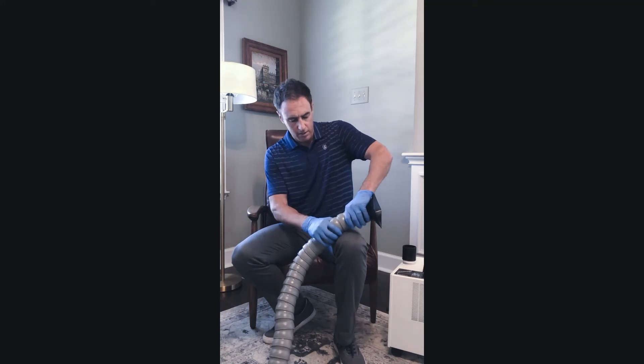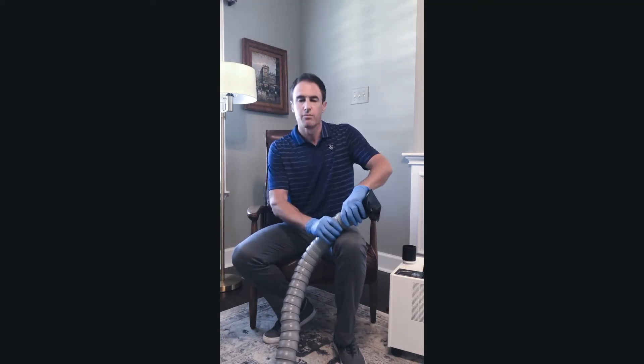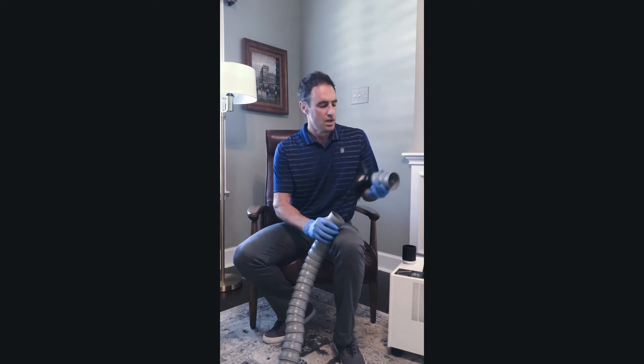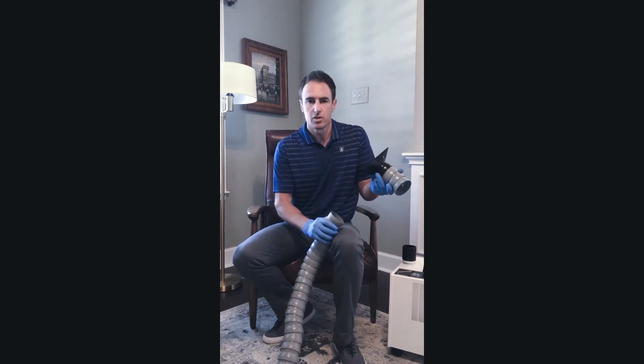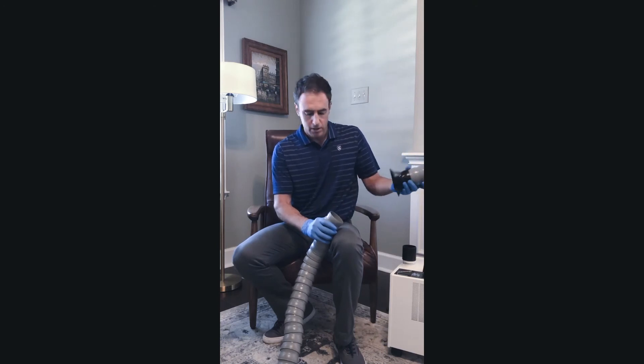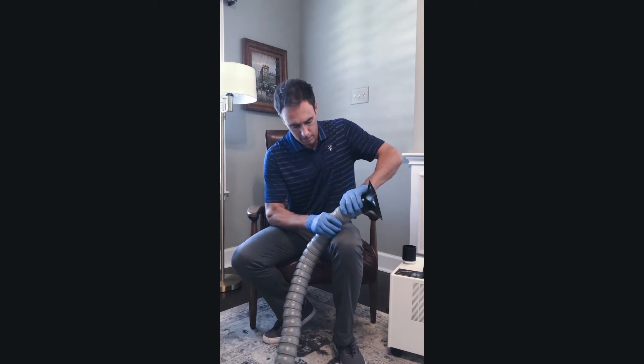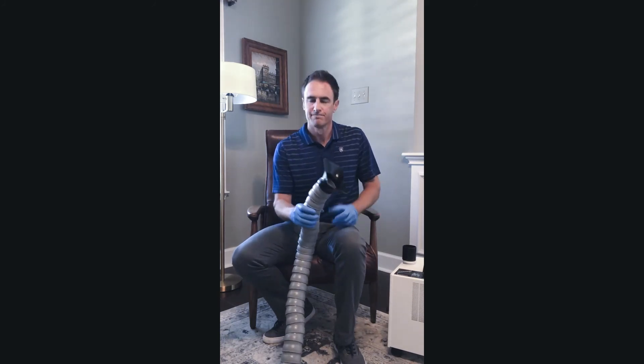You grab here and here and, holding it firmly, you bend it over your knee. It comes off really easily. You can wash it in warm soapy water or a calvicide solution. Then to put it back, you just line it straight up and push with a little bit of force — it should pop right back in. And there you go.